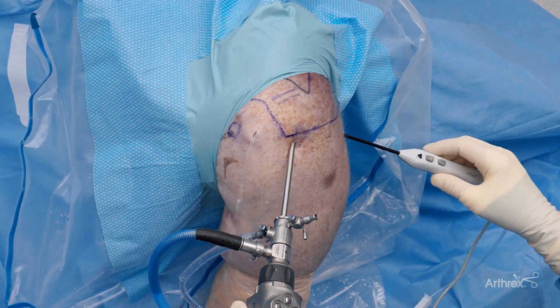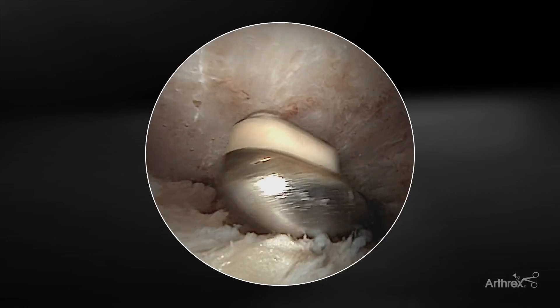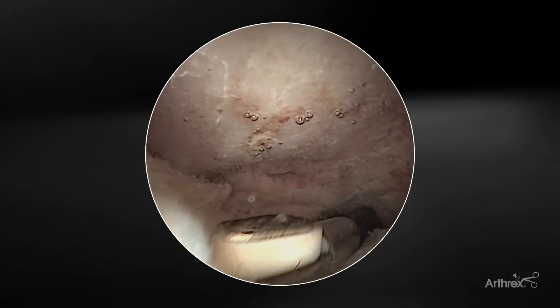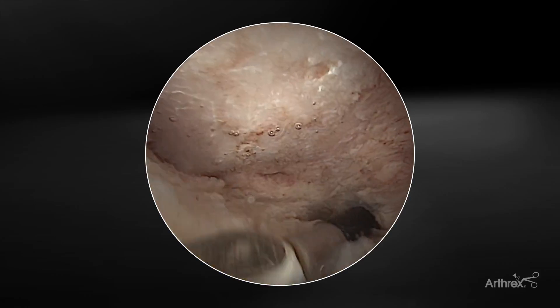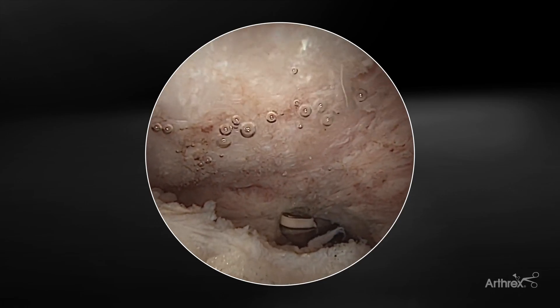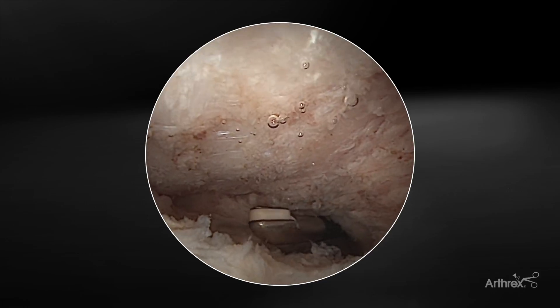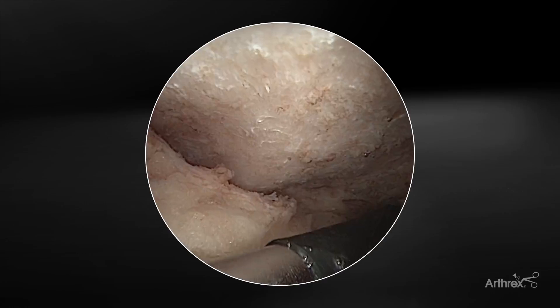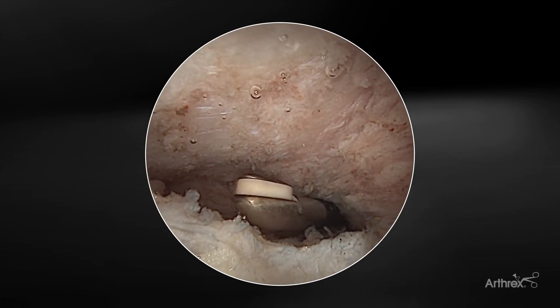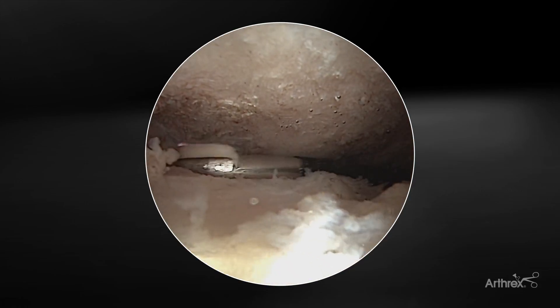Viewing from the lateral side, instruments coming in posteriorly. We've completed our subacromial decompression, released back to the scapular spine, and our lateral gutter is released in preparation for our lateral row anchors. The bone is ready for an acromioplasty if indicated. In wrapping up, the beauty of this device is it's unbelievably efficient at removing tissue in a volumetric fashion, but it's also extremely precise due to that well-contained plasma field and the edge control. This can be utilized when resecting tissue in the subacromial space and prepping for a cuff repair or acromioplasty, but it can also be used around sensitive tissue like cartilage or labrum due to that edge control and precision on the edge of the i90.